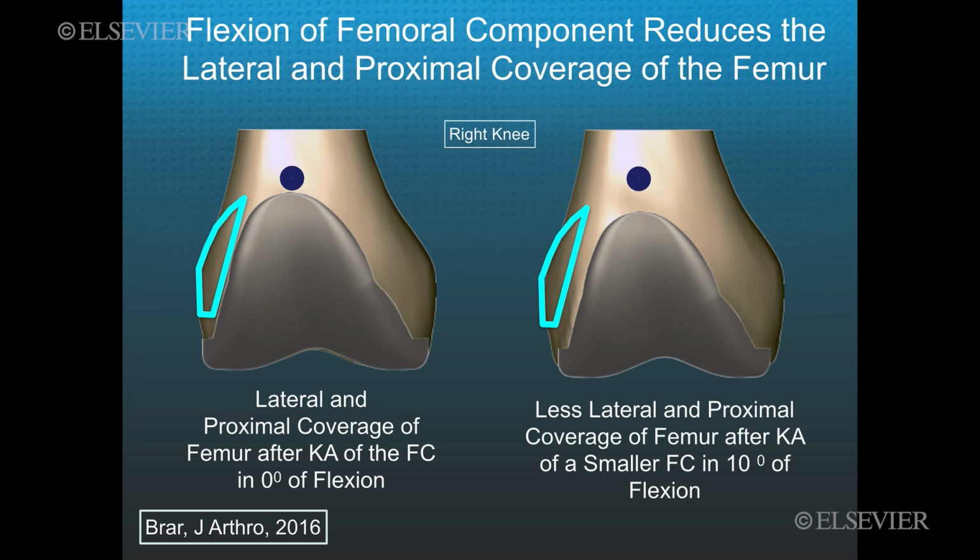And this then leads to a higher risk of delayed engagement of the prosthetic patella button or implant into the prosthetic trochlea.